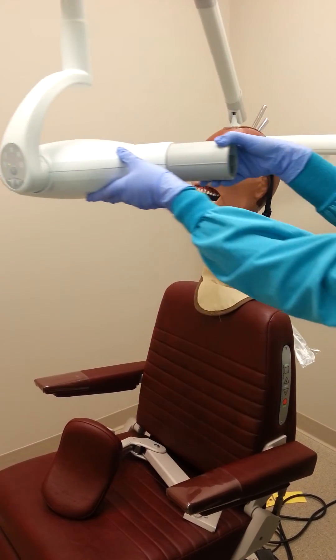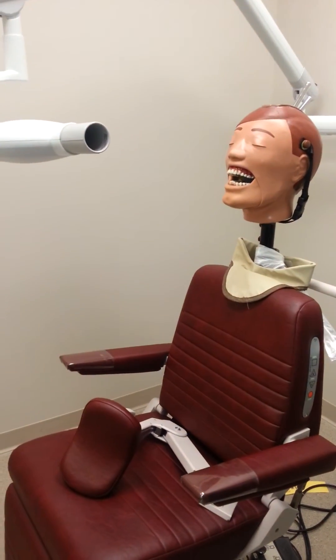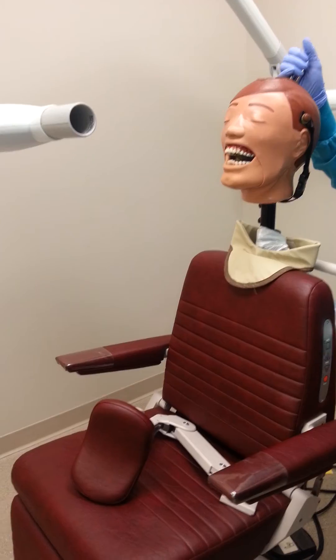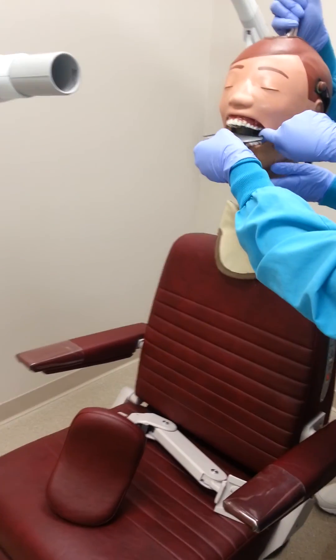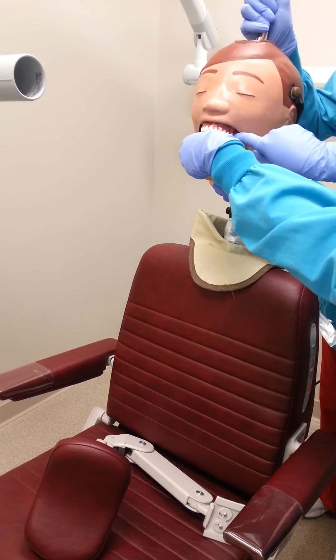Once our machine is ready and set, we will need to place the size 4 phosphor plate anteroposteriorly or horizontally along the occlusal plane of the patient. For a child, we would use a size 2 film that will be placed on the long axis laterally.